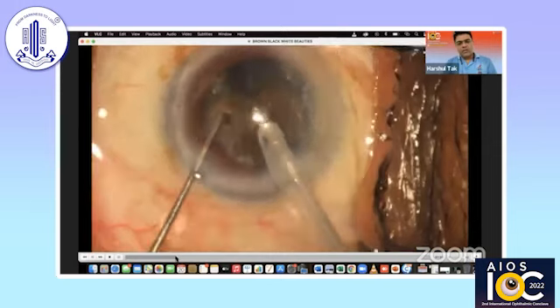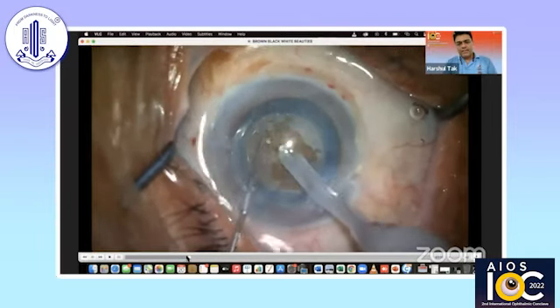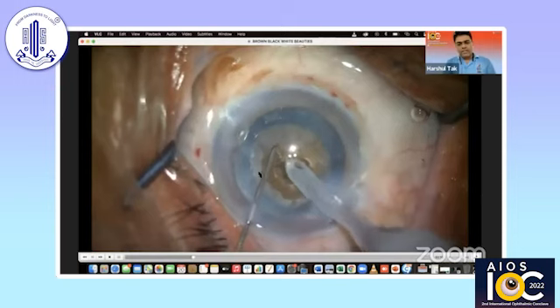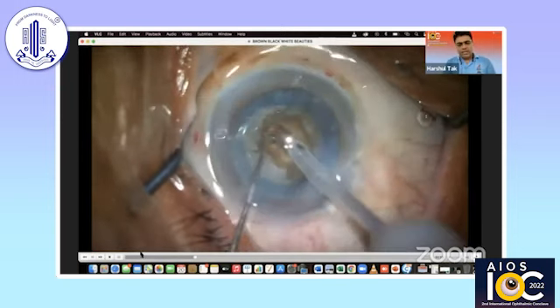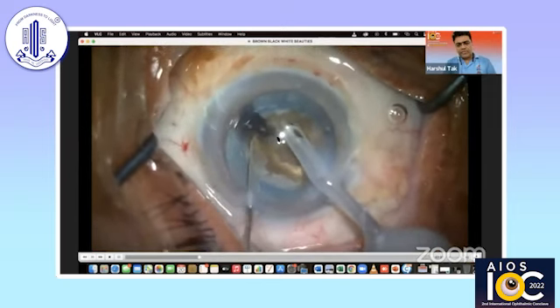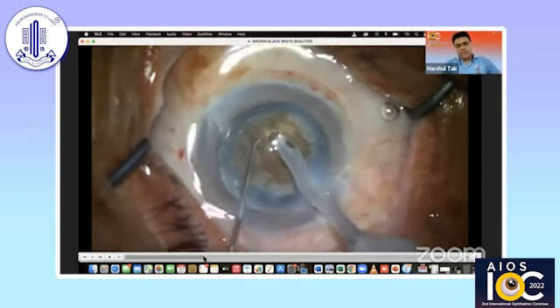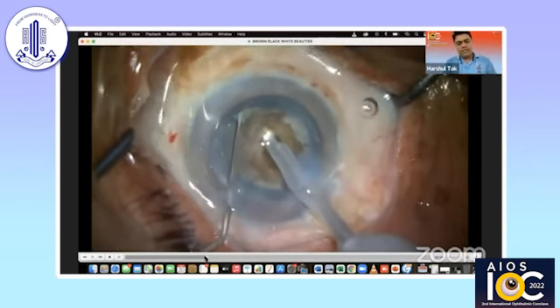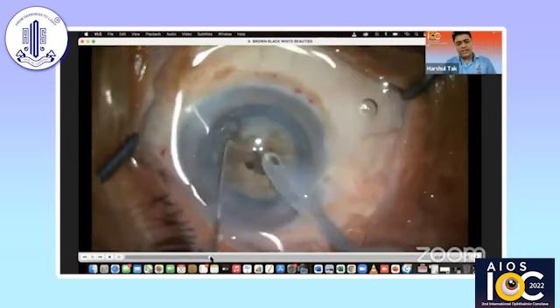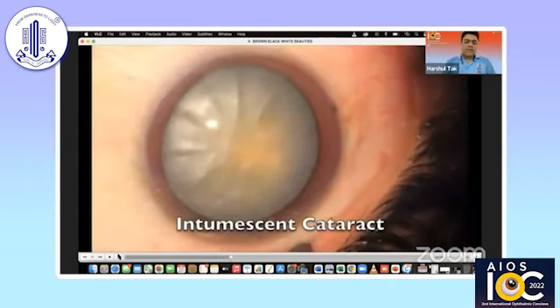You can see these pieces are being taken out like pieces of cake. Coming into one more case, you can see I'm drilling in the center. And once you drill deep enough, I go ahead and hold the nucleus, get my chopper from a little bit periphery and you can see the crack propagates anterior to posteriorly. You need to use cohesive viscoelastic OVD in between to protect the corneal endothelium, because of course these cataracts need higher energy than normal cases. This is the technique which I use for brown and black cataracts.